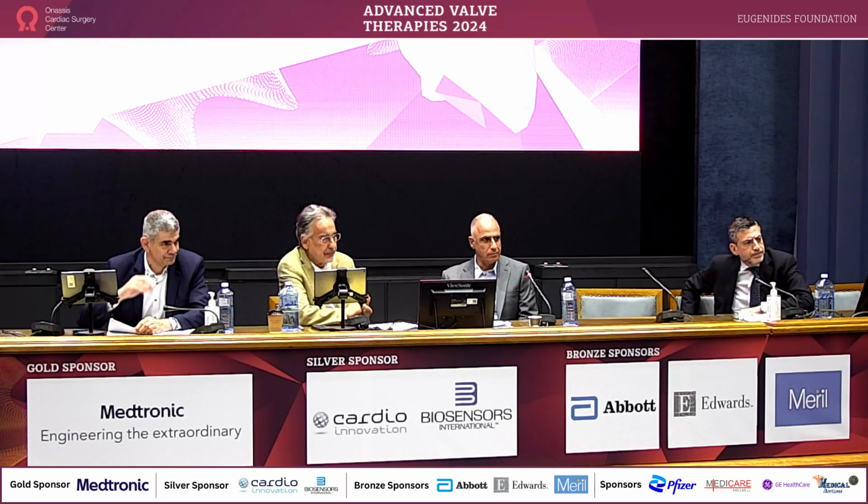Vlasis, thank you very much for this excellent case, but I want to alert and take into account the aortomitral curtain. Exactly. This is very important, and sometimes it will be very dangerous if you haven't got a complete ring, and if you do tip to base laceration. This is why base to tip laceration is recommended.